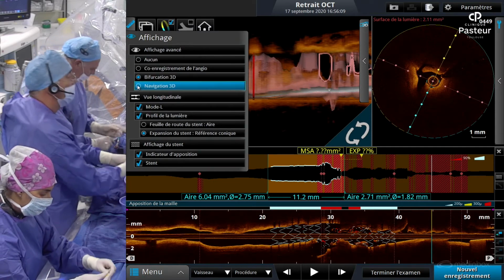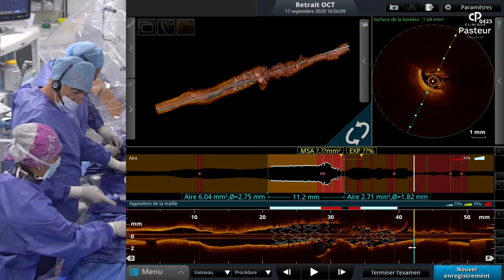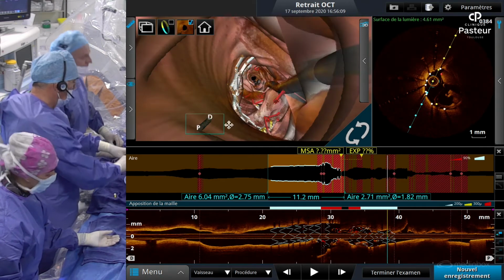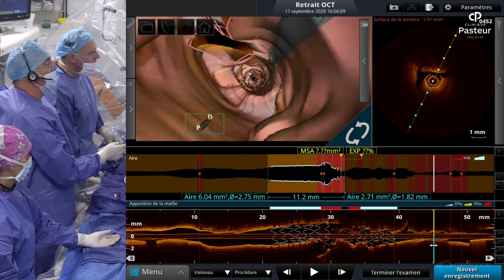Tiens. Ok. Ça fait une... Oui. Non, j'ai pas fait. Il y était. Ah oui, c'est tout à l'heure. C'est nouveau? Non, c'est l'ancien. Ah bon. Good. Donc maintenant, il faut la scopie, fluoroscopie.